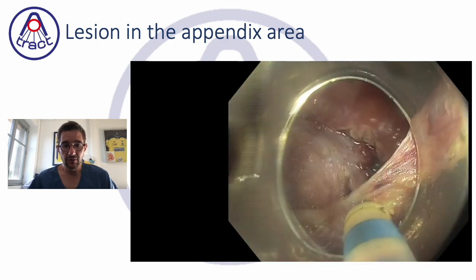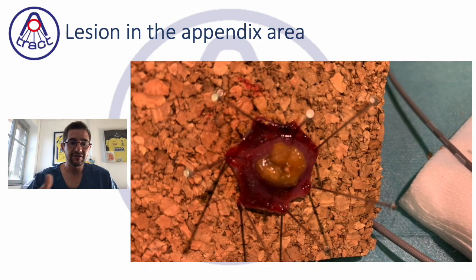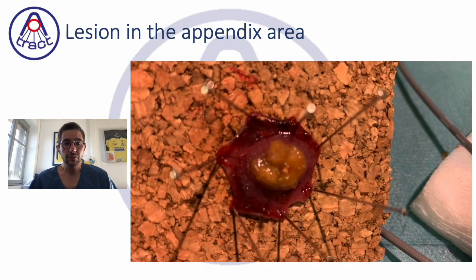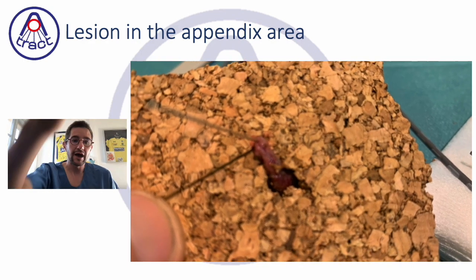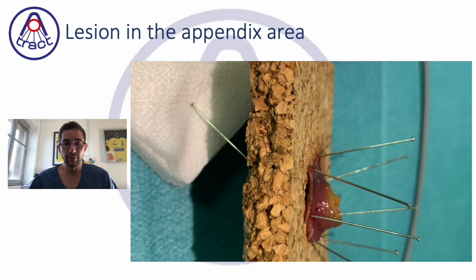And therefore, we will go deeper and deeper to cut the appendix as deep as possible in order to obtain a long appendix mucosa to obtain a deep margin.